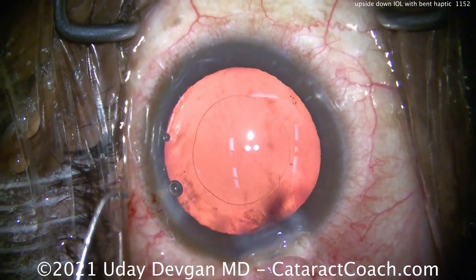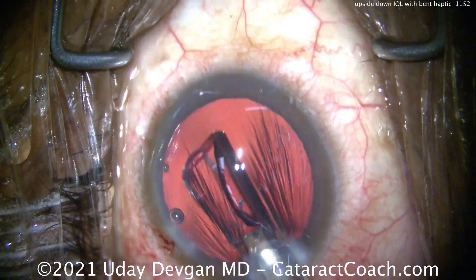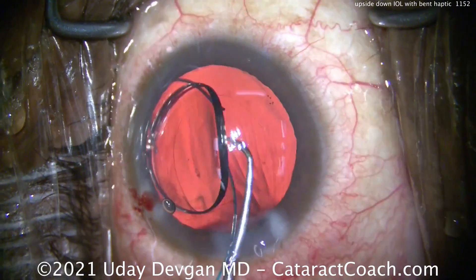Here's the case: highly dilated eye, nice-looking capsulorrhexis, eye full of viscoelastic. Here comes the lens, and the leading haptic is folded over the wrong way. The lens was clearly misloaded.